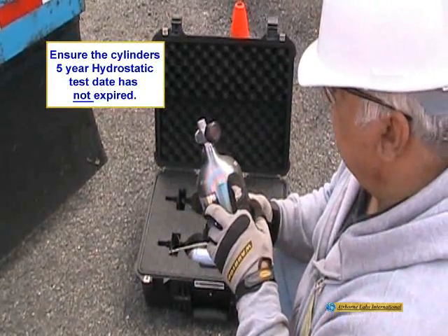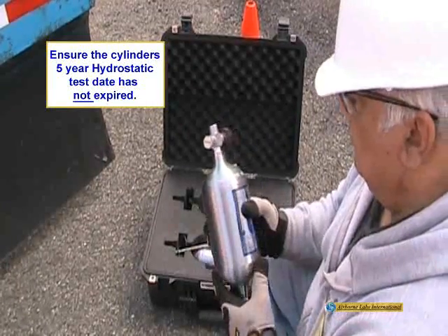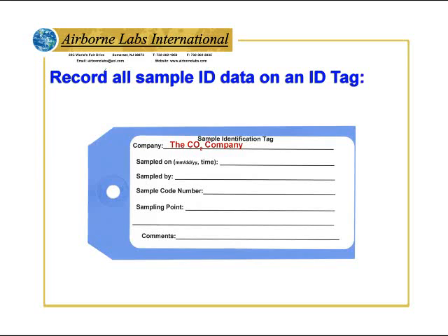Ensure that the cylinder's 5-year hydrostatic test period has not expired. Do not use the cylinder if it is beyond this retest date. Record all ID data on an ID tag.